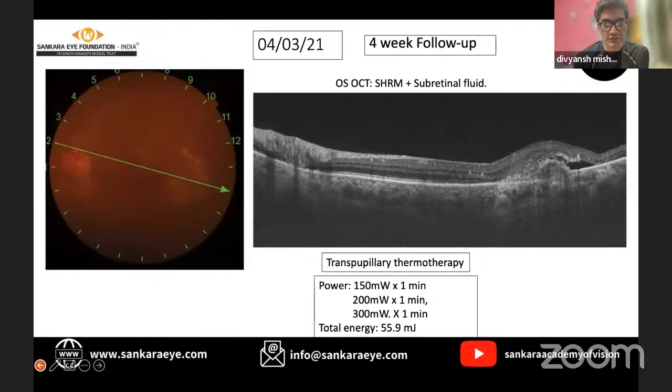It's not the kind of laser that we use for focal laser or PRP, so you would not actually see a scar at the end of the treatment. You would just see a faint whitening, a very subtle and deep whitening. It's not like a laser that produces a chalky white. It would be a very deep whitening inside because we are gradually heating that area, and that's how the destruction of the CNVM occurs.